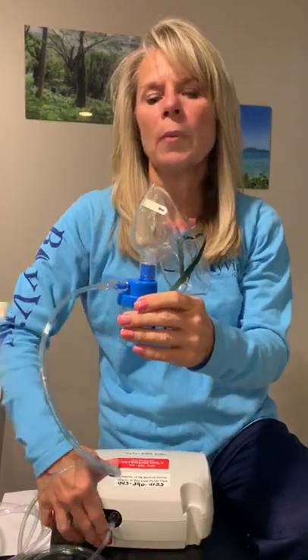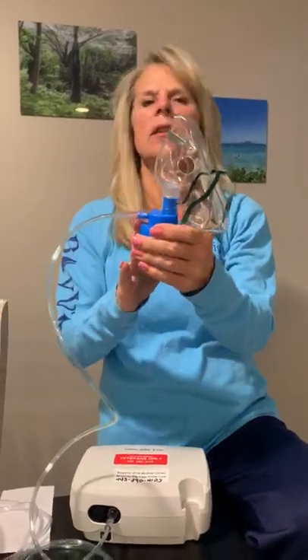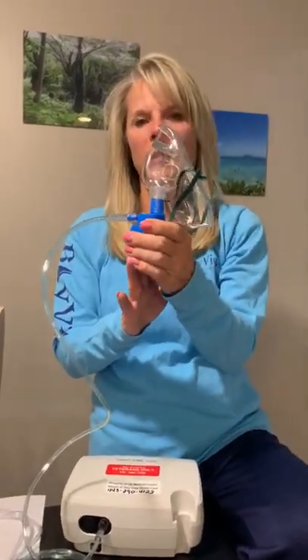Just make sure you breathe in and out through your mouth only. Because it's not in your mouth, try not to breathe in through your nose. And that's how to take the treatment with the face mask.